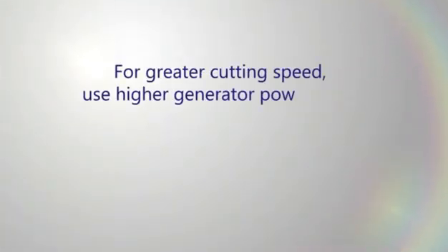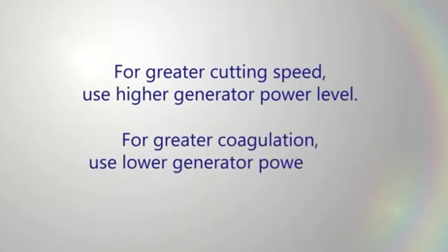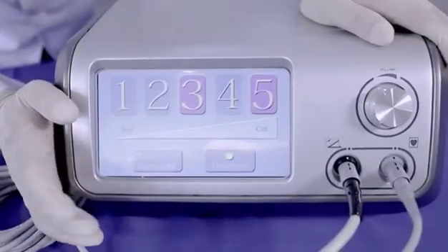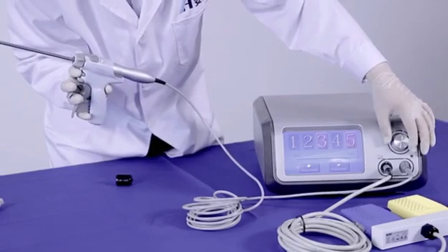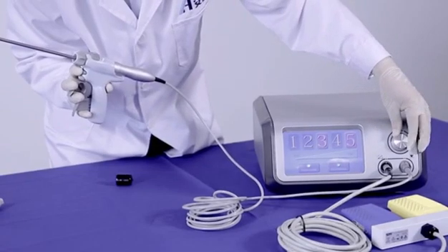For greater cutting speed, use a higher generator power level. For greater coagulation, use a lower generator power level. Manual control and foot control can be selected on the home screen. The green indicator means the manual control or foot control is effective. Adjust the volume to the proper level.